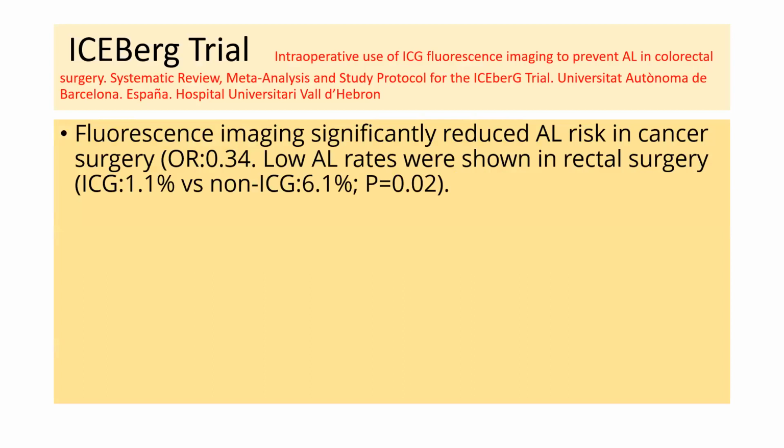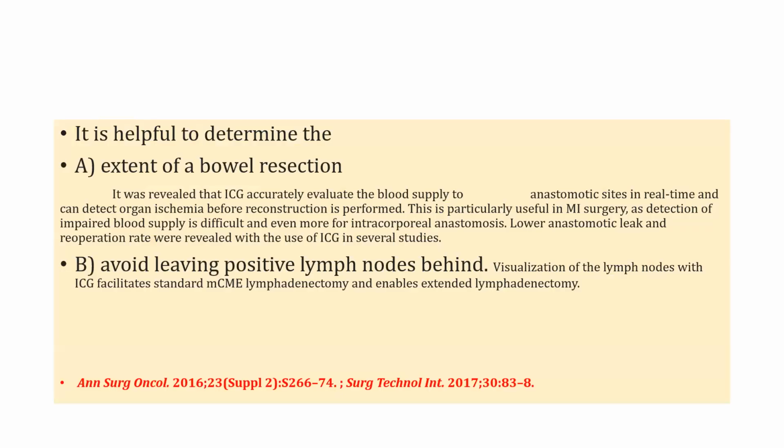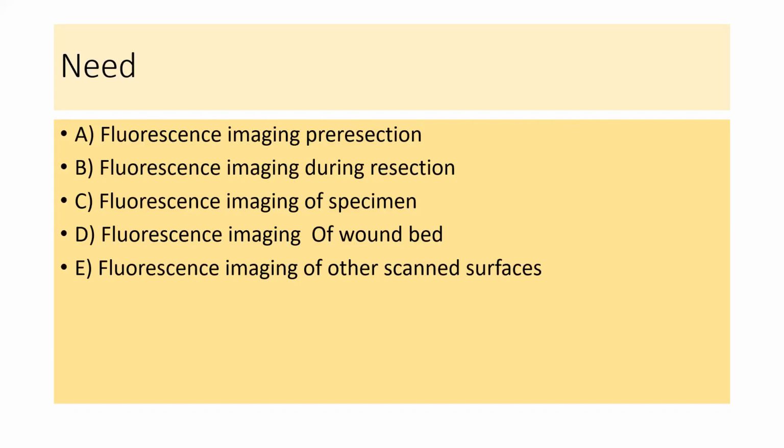Then there is the ICEBERG trial, which has again proven that. So there are n number of studies available, but the fluorescence imaging is to be done at multiple times, 2 to 3 times during the operative procedure. That is very important.